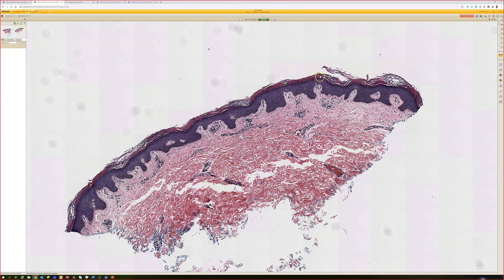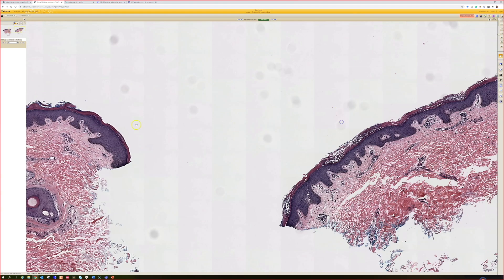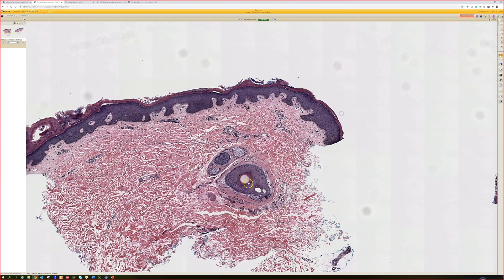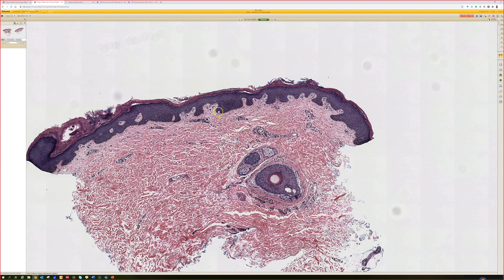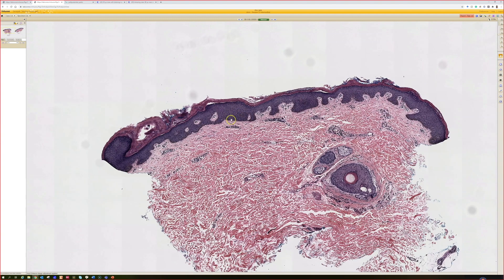It almost looks like acral skin a little bit, but we know it's not because it's got follicles. Although admittedly the sides of the hands — you can have hair there and it starts to look acral. But this is a little acanthotic and it's got a thick layer of compact ortho. That is such an important clue, not only for dermatophyte but also for this disease.